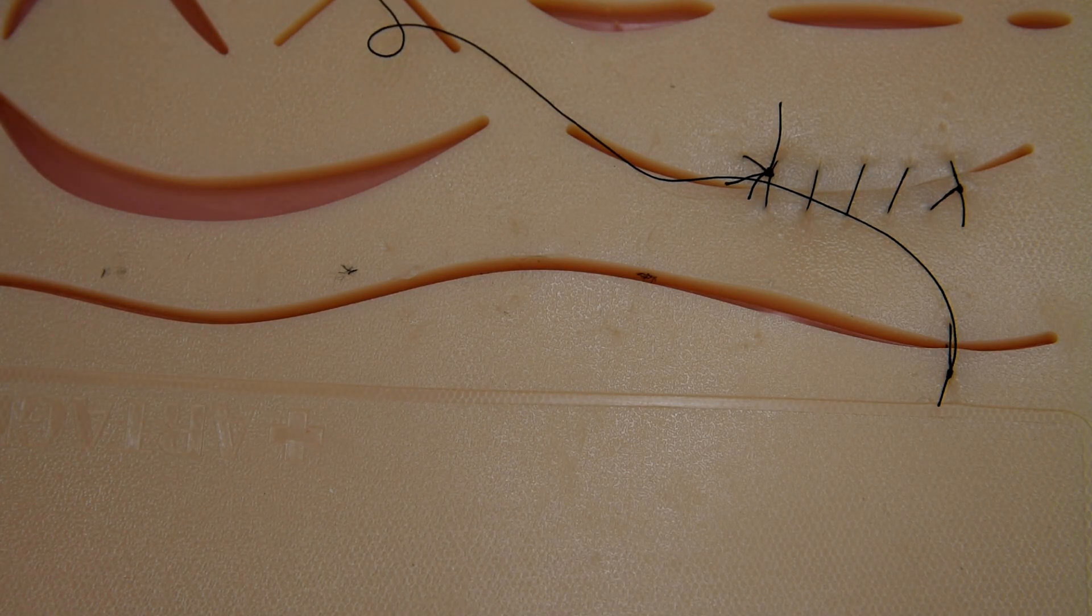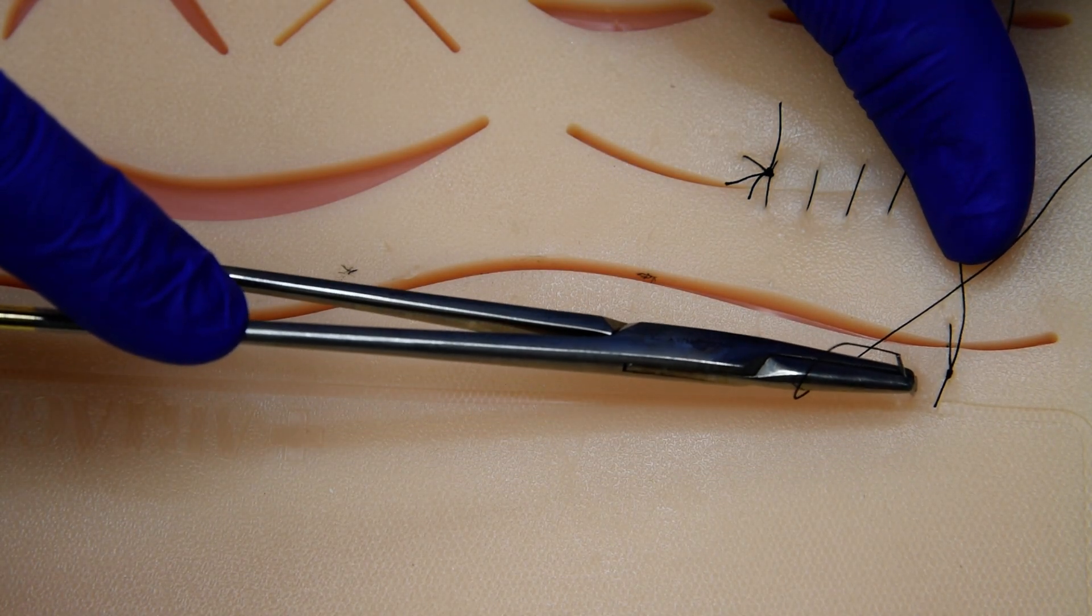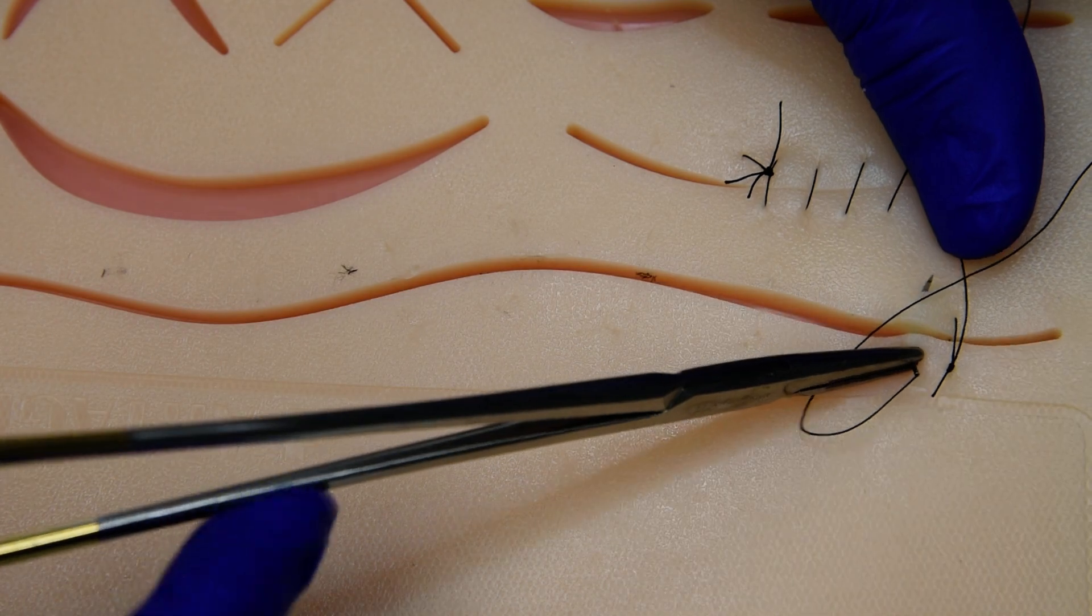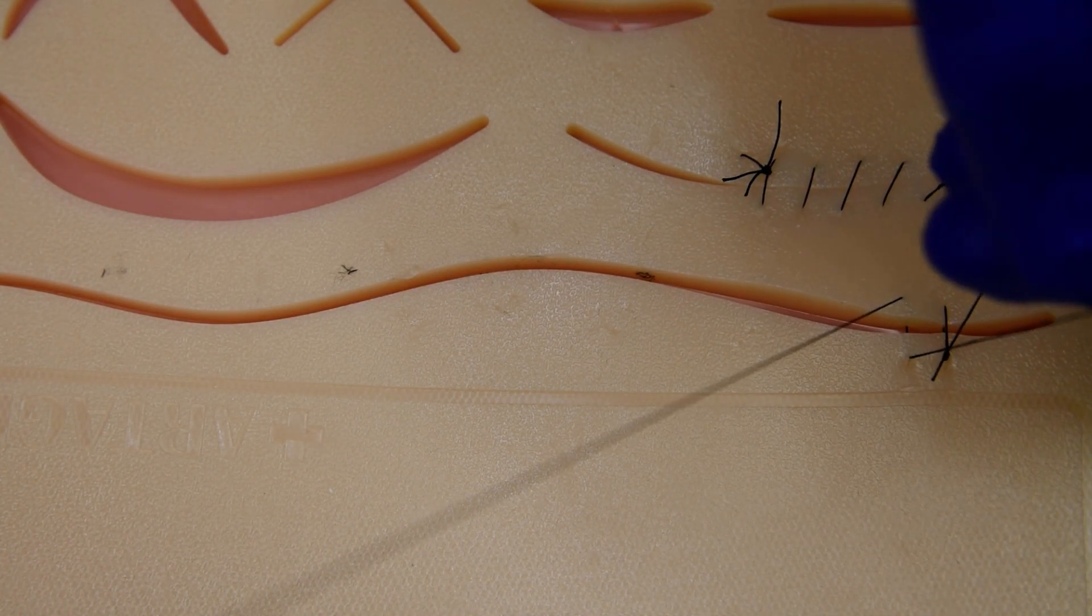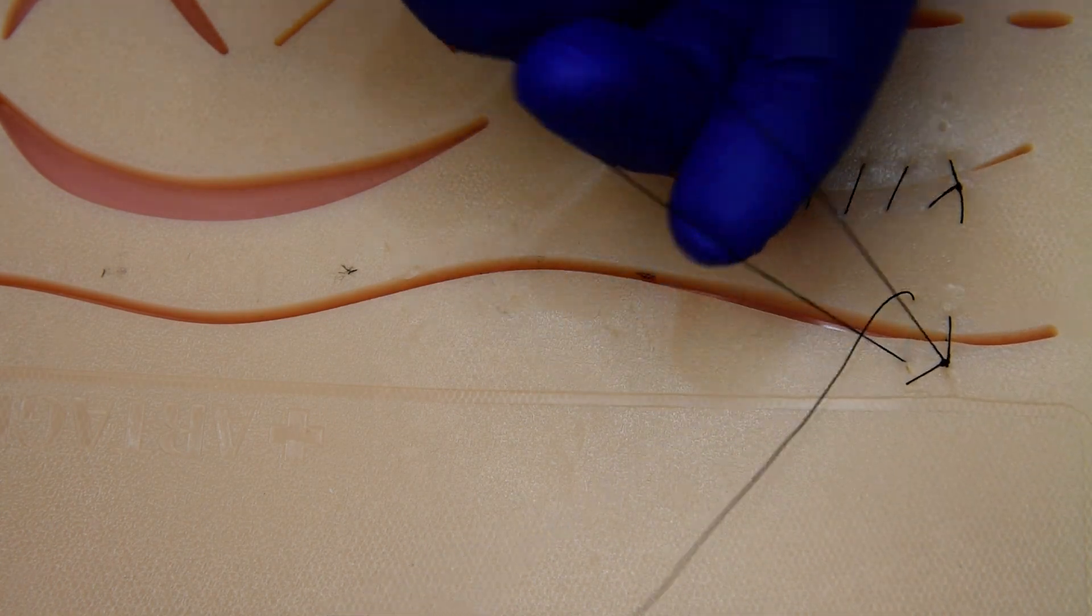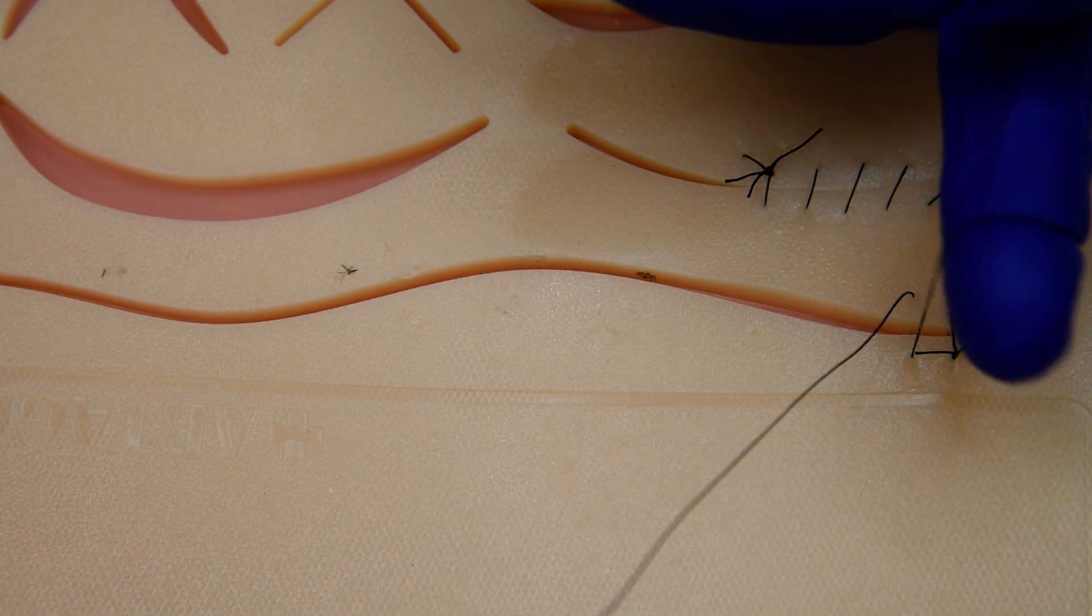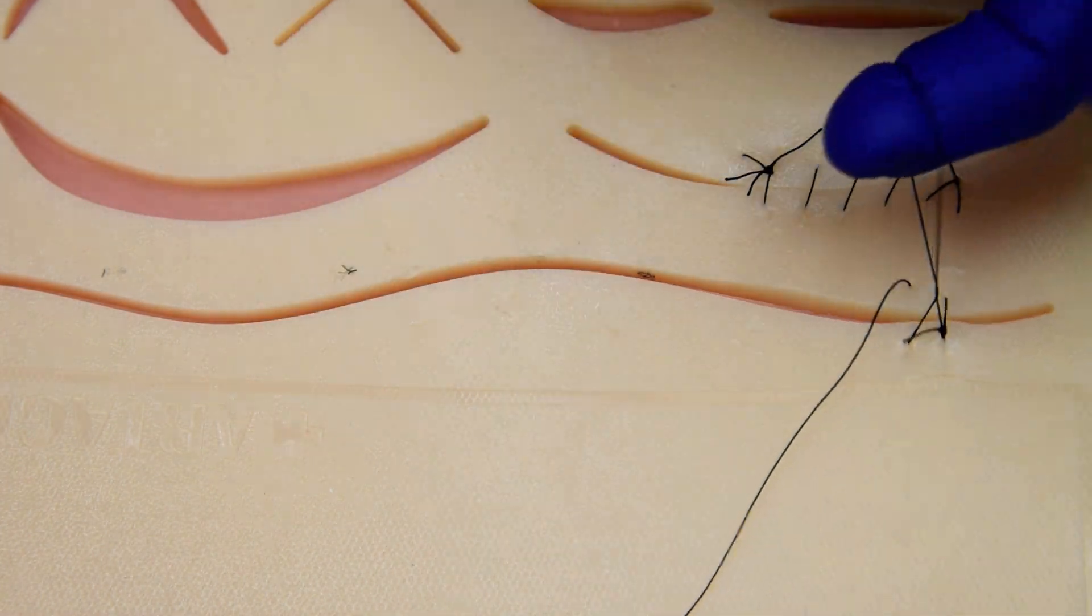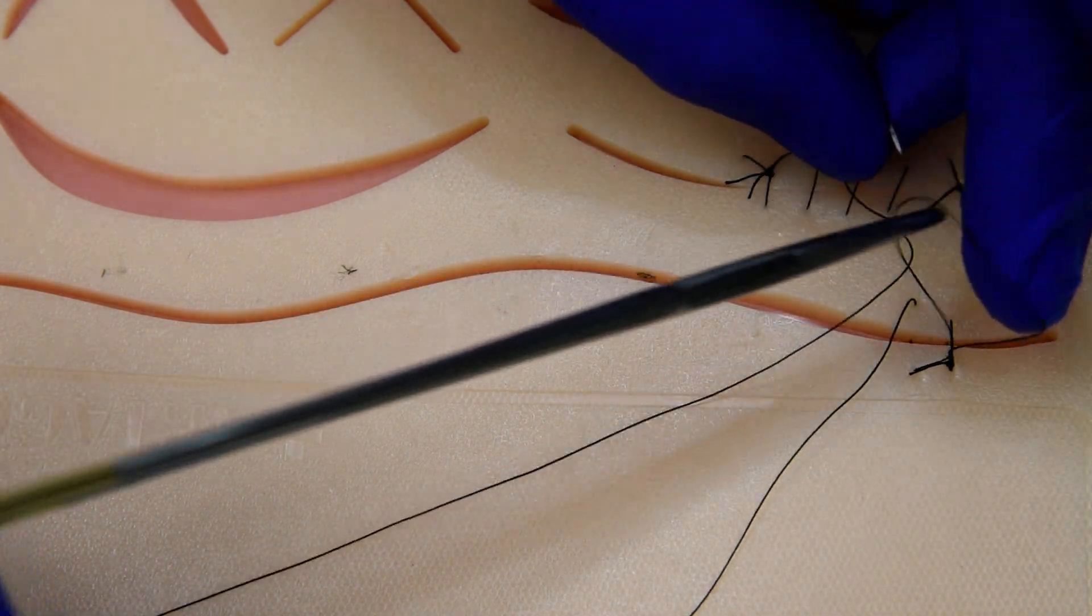So we'll start similar to the simple continuous. We're going to do another bite about three to four millimeters adjacent, three to four millimeters deep. But rather than simply cinching this, we're going to leave the loop, and we're going to twist the loop all the way around once and pass our needle through it to ourselves.